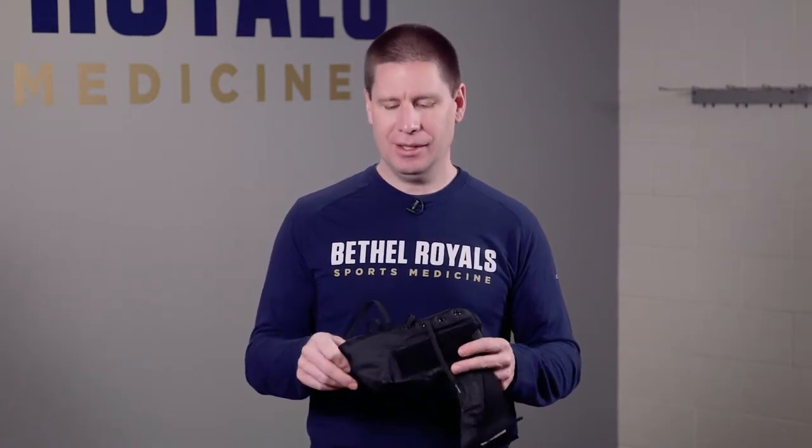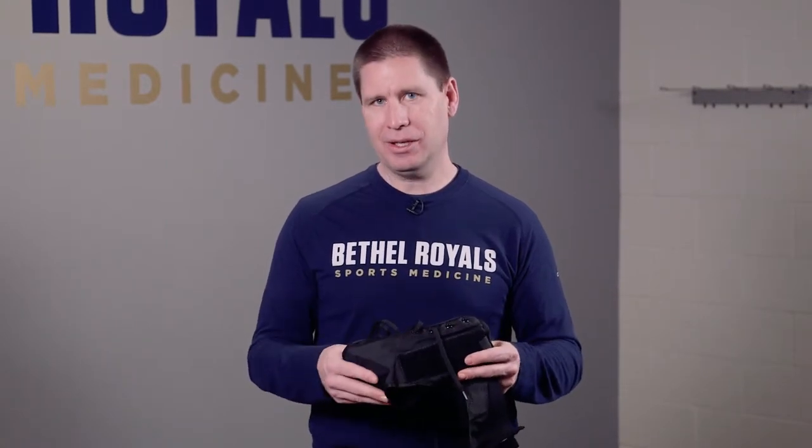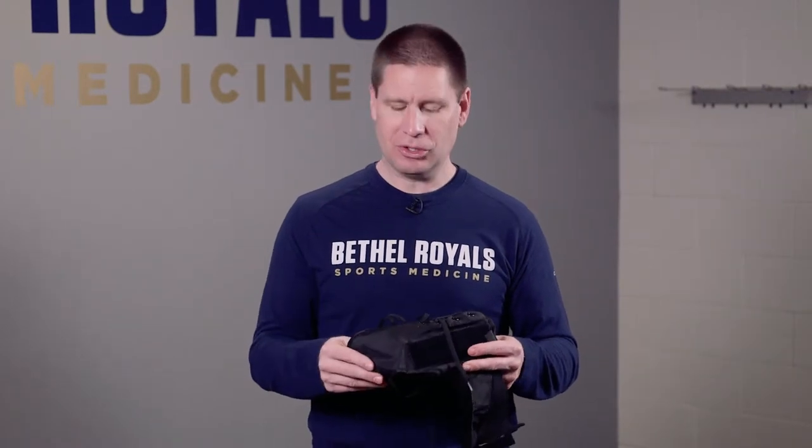At that cost, if an athlete uses an ankle brace for a season, it doesn't take very long — about two weeks to equal the cost of taping. So if you're going to be taping an ankle longer than two weeks, it's always beneficial to go to a brace.